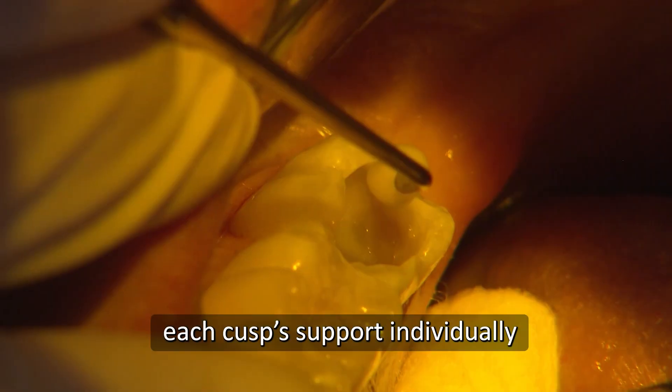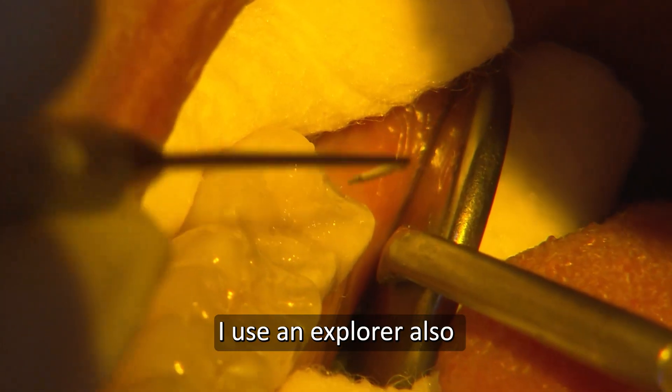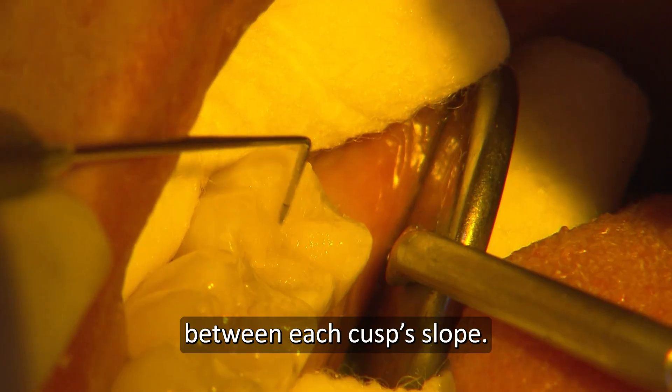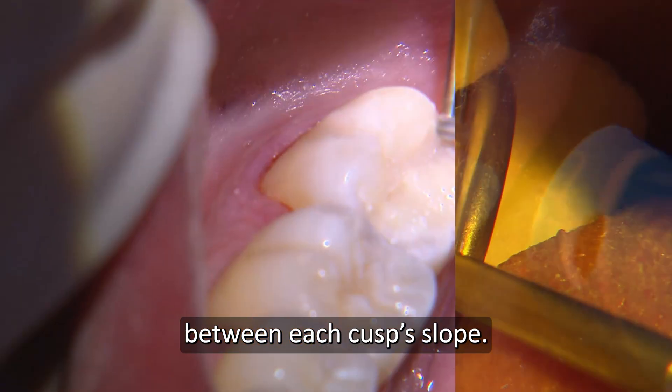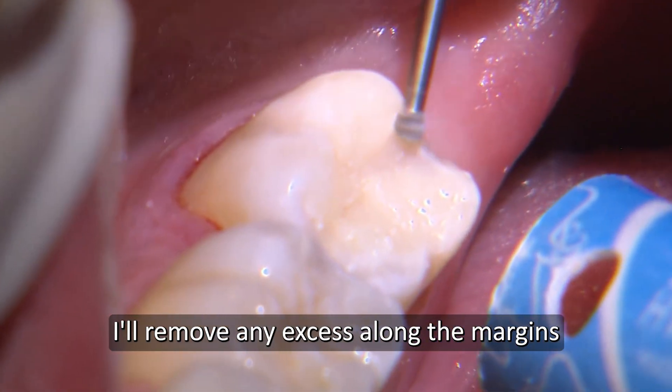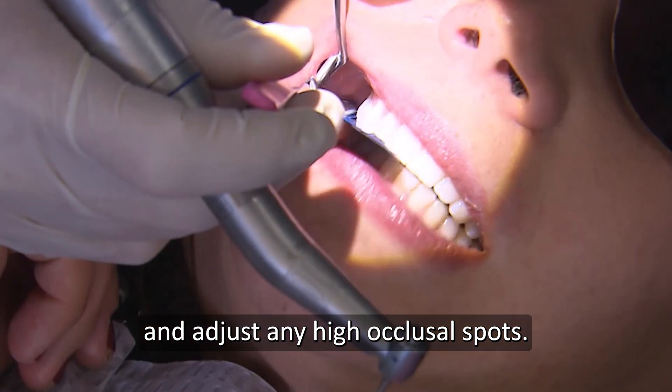I place and cure each cusp's support individually. I use an explorer also to define at the end the primary anatomy between each cusp slope. With a slow speed round burr, I'll remove any excess along the margins and adjust any high occlusal spots.